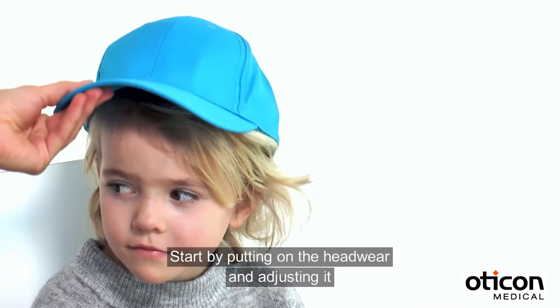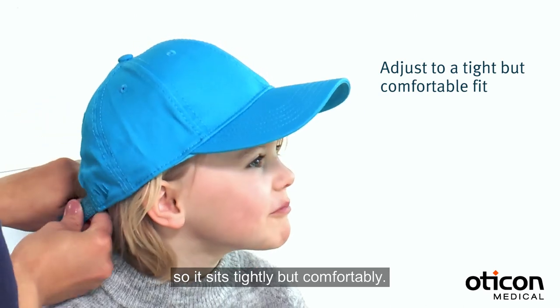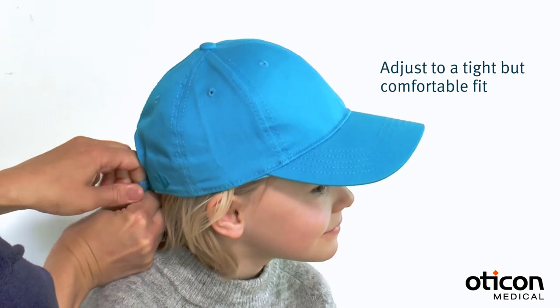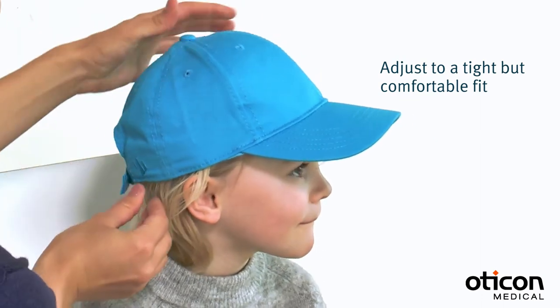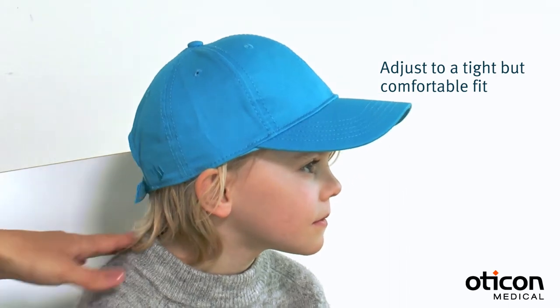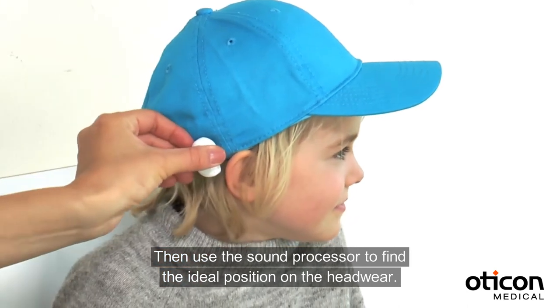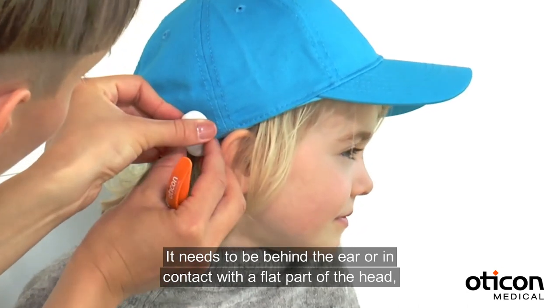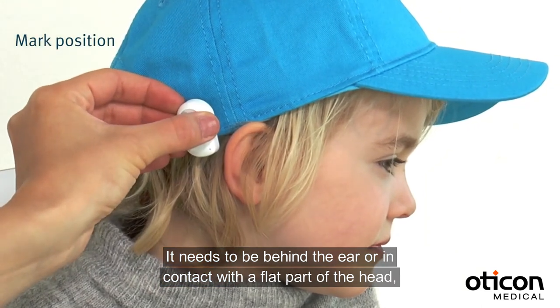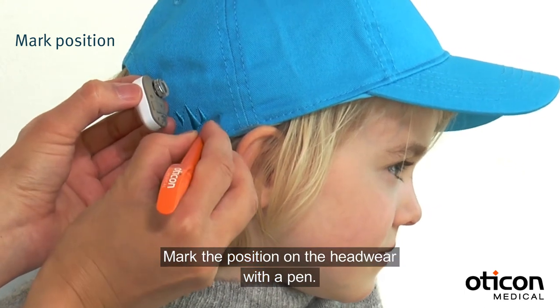Start by putting on the headwear and adjusting it so it sits tightly but comfortably. Then use the sound processor to find the ideal position on the headwear. It needs to be behind the ear or in contact with a flat part of the head such as the forehead. Mark the position on the headwear with a pen.